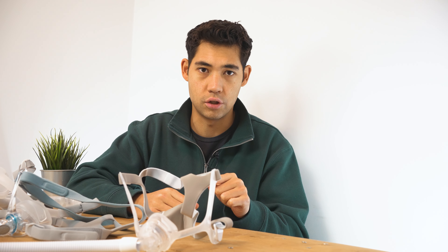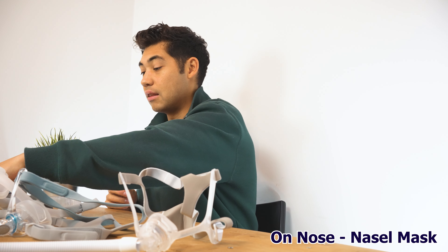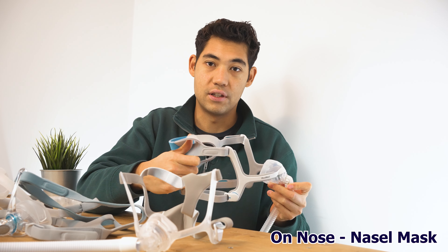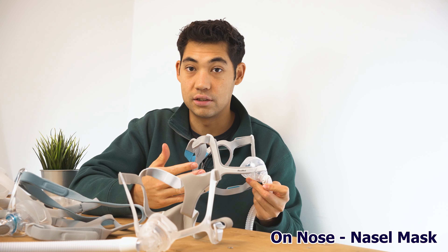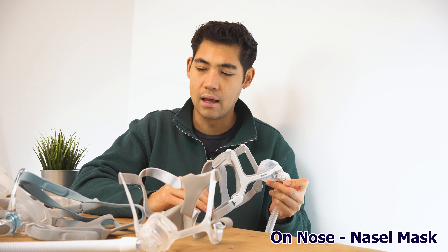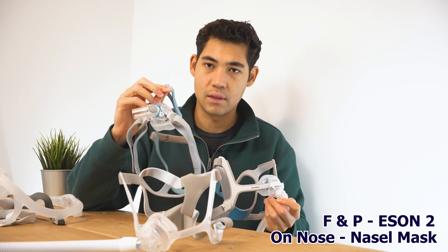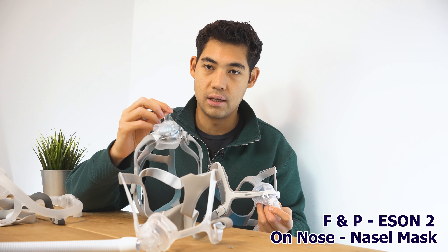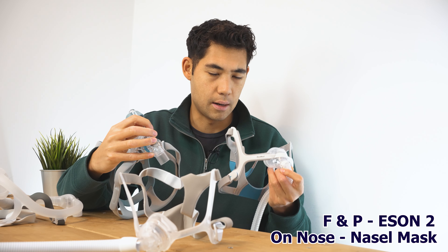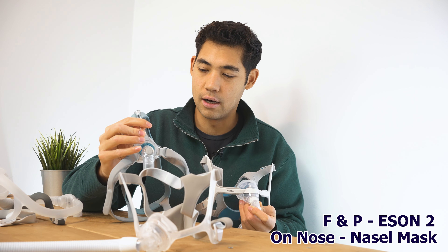The first category is the on-nose nasal mask. If you've seen my top masks of 2023 video, you'll know I picked the ResMed AirFit N20 — a really awesome mask that fits a lot of different head shapes with great positive feedback. However, I've changed my opinion. I now prefer the Fisher & Paykel Eson 2 over the N20, so I'm picking the Eson 2.